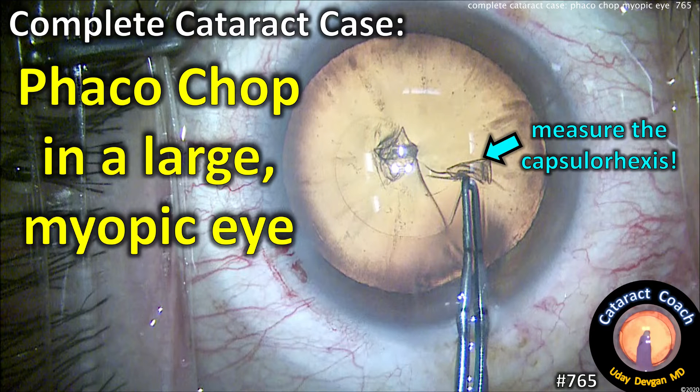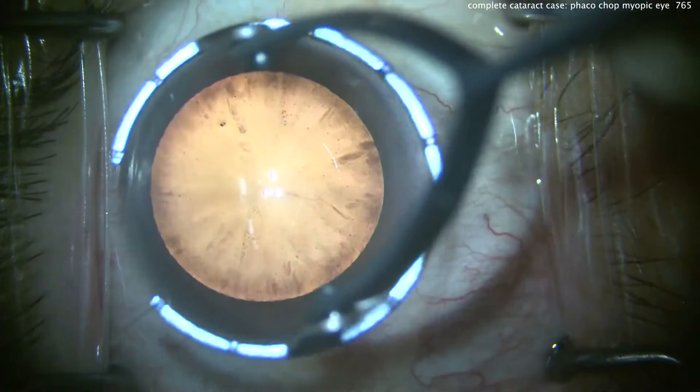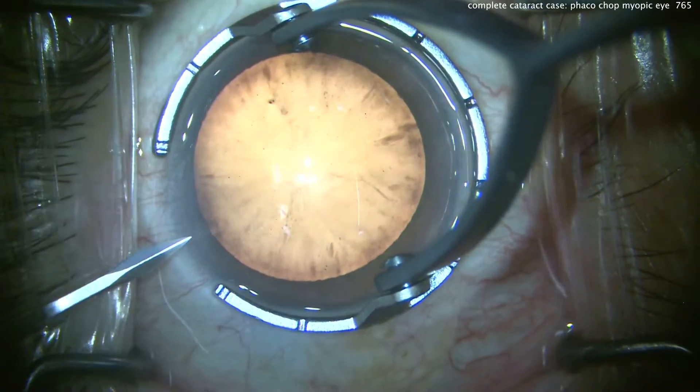CataractCoach.com — a complete cataract case featuring phaco chop and a large myopic eye. We've got a lot of good pointers here in this case, which we'll show you from start to finish.